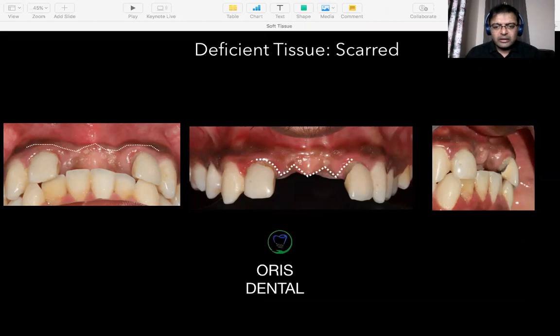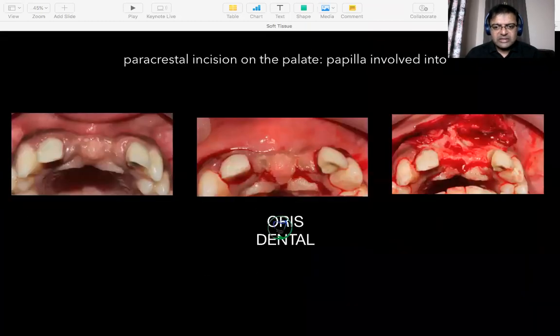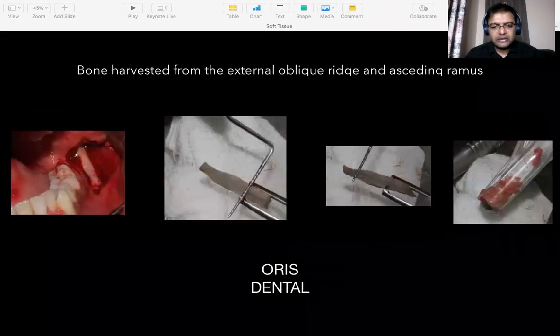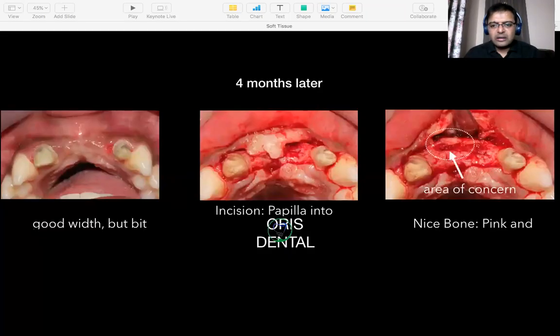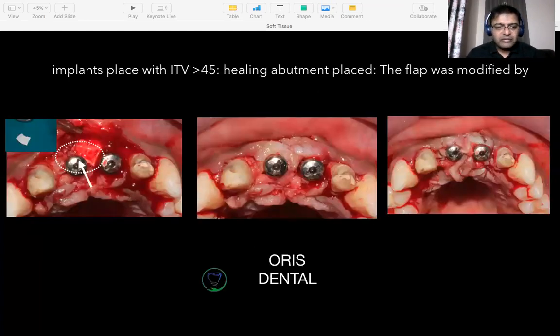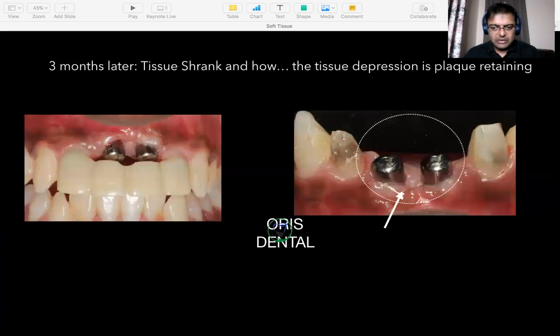Very similar tissue again, similar situation, central incisors where we had done a Khoury block. Let's skip through that. When this patient came back for implant placement again, we did an incision. The implants went in, and in some areas the graft had not taken up. We did a volumax there, some graft. The stability was good, so the healing abutments went in at the same time.